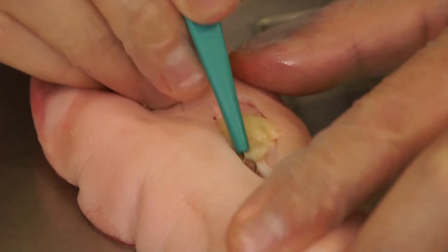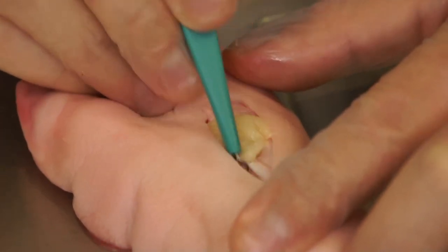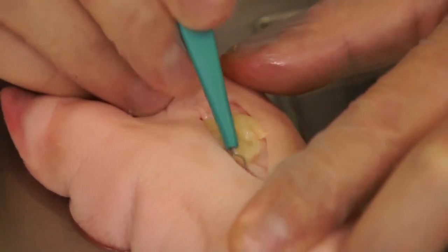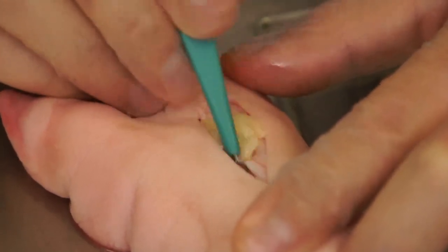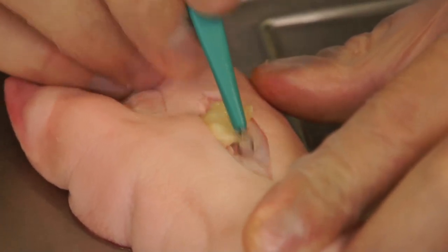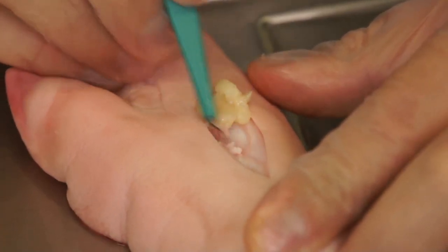Using short strokes, the physician will begin to remove the necrotic tissue from the underlying healthy tissue, as demonstrated in this video.